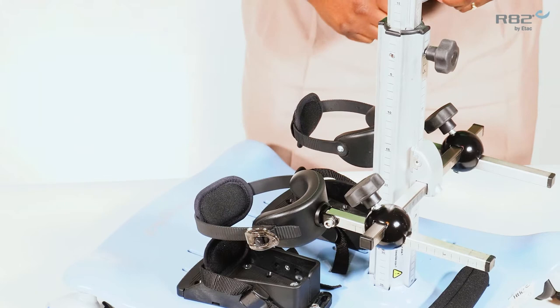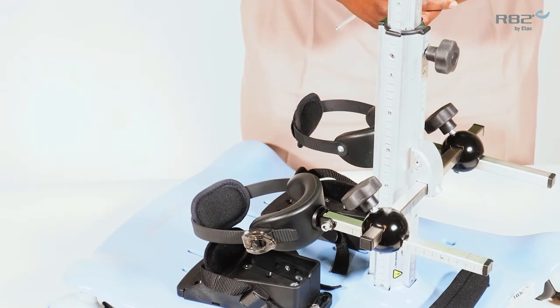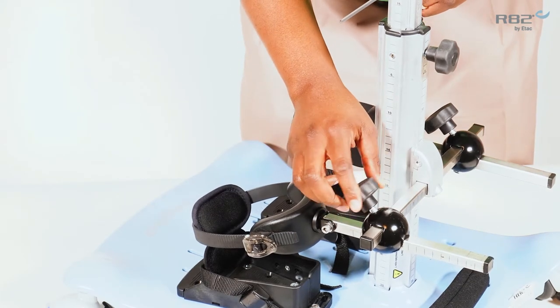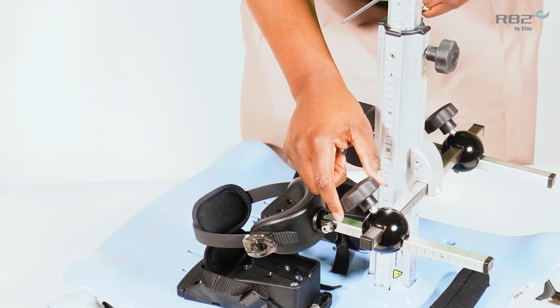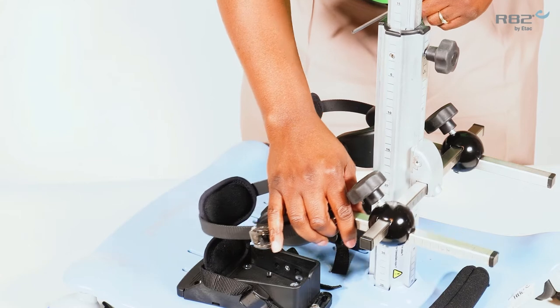The knee supports are height, width, and depth adjustable. I have replaced the standard inset screw with a daily adjustment knob, making width adjustments easy. To adjust the width of the individual knee support, simply loosen the daily adjustment knob and adjust the width support laterally.